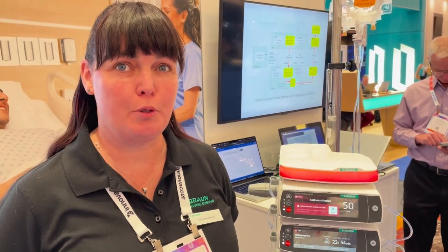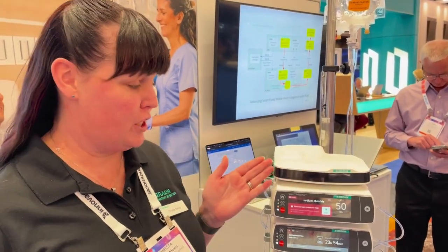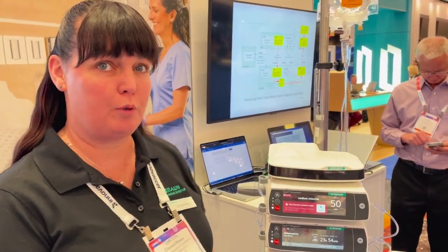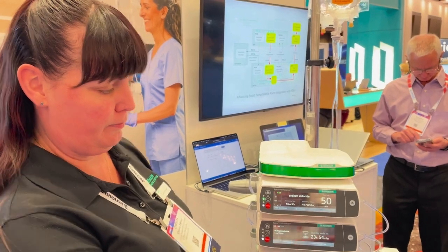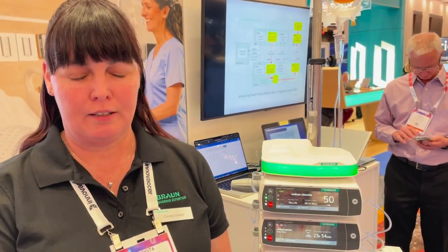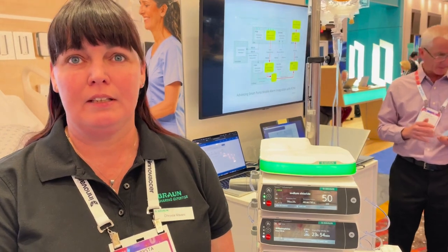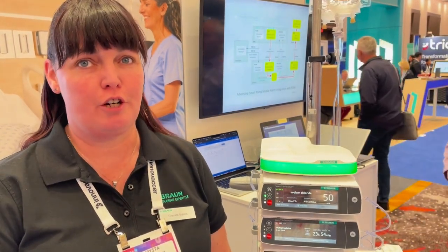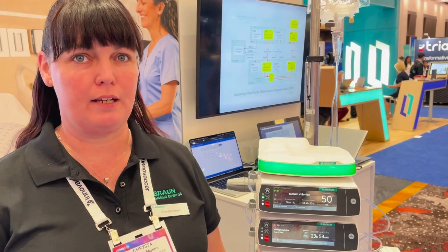So the nurse enters the room finding that the patient has bent his arm, which is now causing a downstream occlusion. She is then able to address and restart the infusion, resolving the alarm and getting the infusion running again. This ideal workflow allowed the nurse to intervene, minimizing any potential interruption to the patient's infusion therapy.